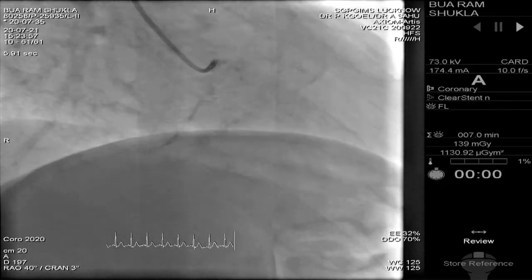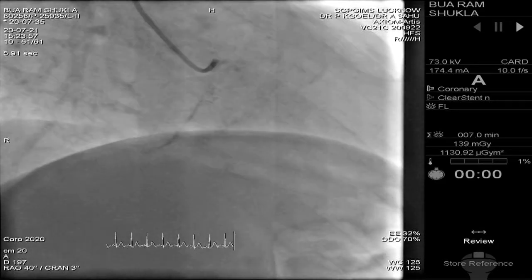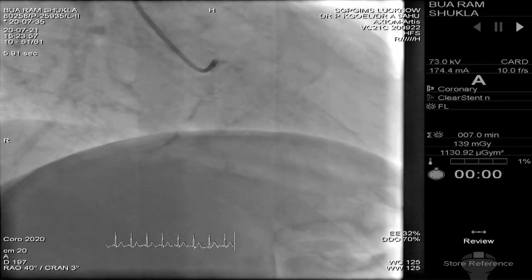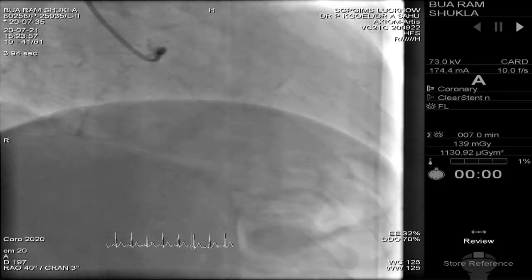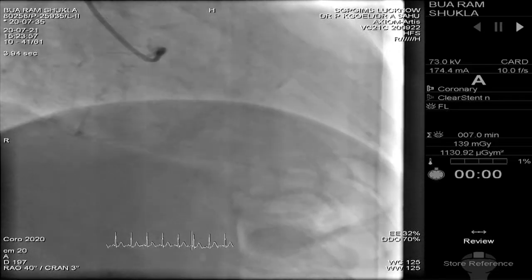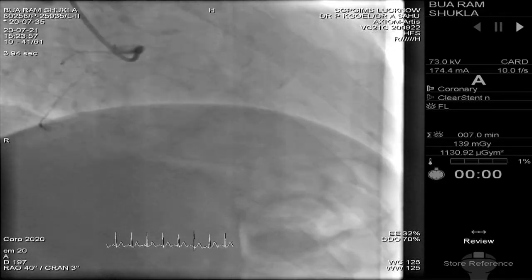No, that's right on. There is a little bit of risk to fixing the LAD first, and some of the collaterals can be jailed, but you can usually get through them with a small 1.5 balloon dilation out of the stent into the septal, so it doesn't necessarily knock off that option for the future. And a little bit of clarity from dual injection angiography will help determine what the strategy could be, either antegrade wire escalation or ADR potentially. But I agree with Ziad, going through that epicardial collateral would really be a last resort.